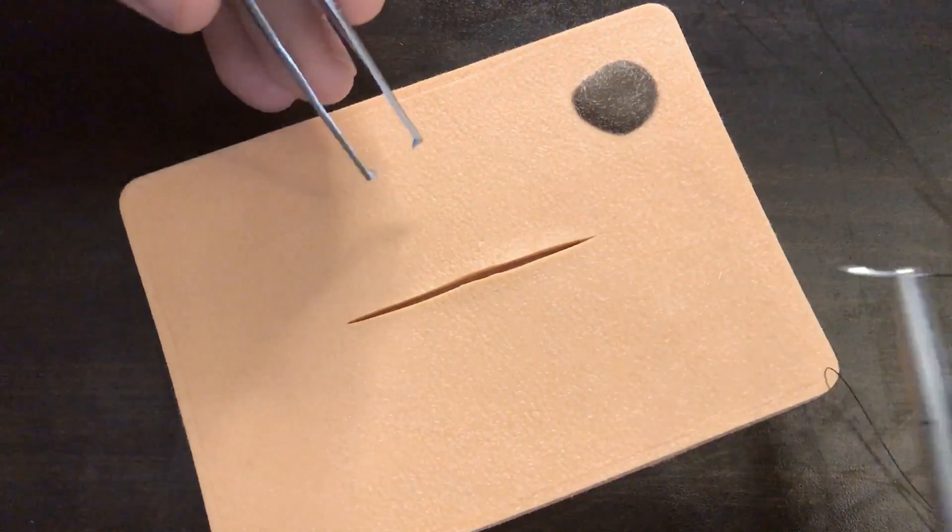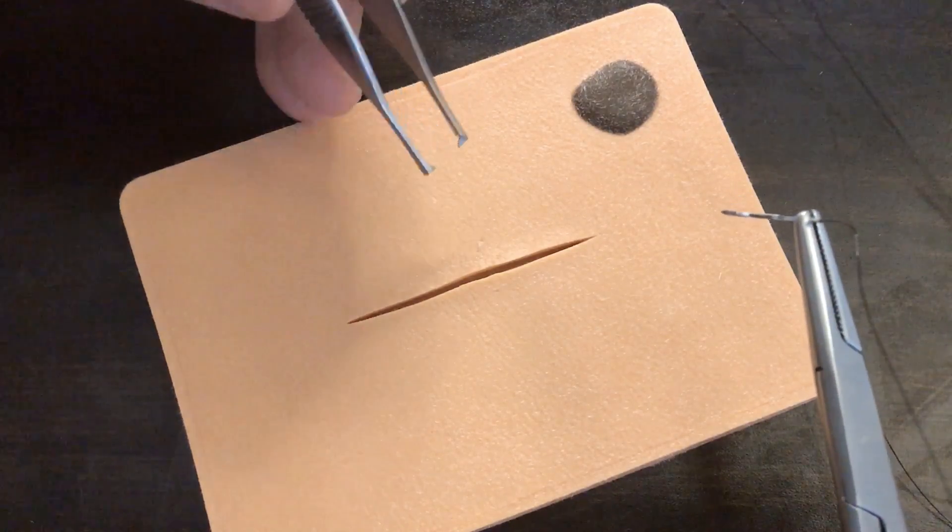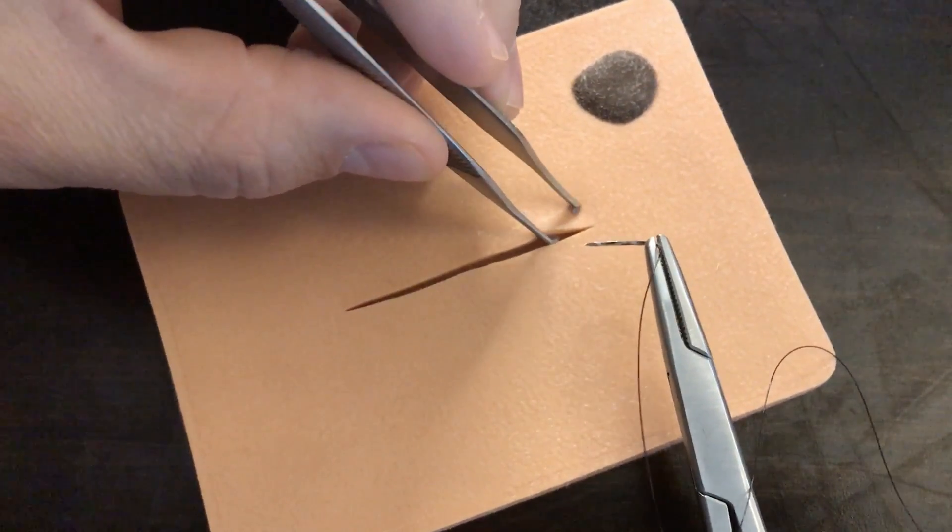In this video I'm going to demonstrate how you do a subcuticular running suture and finish it with what's called an Aberdeen knot. Alright, so let me go ahead and start.